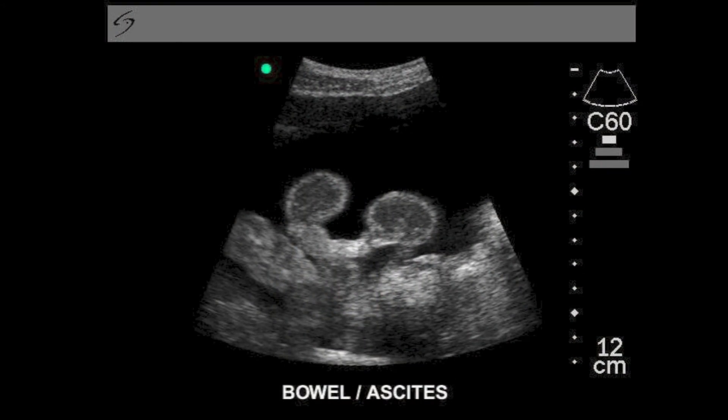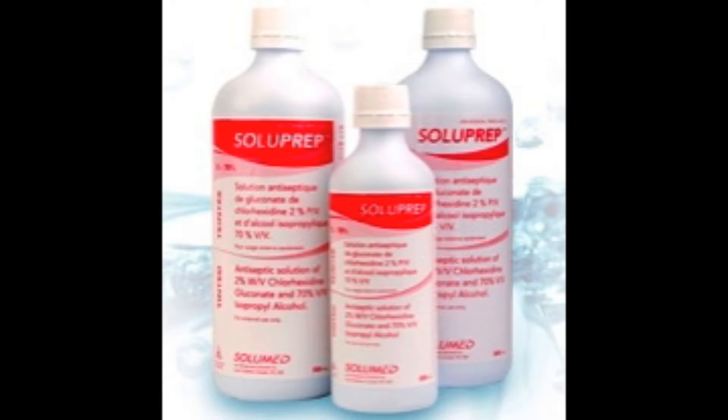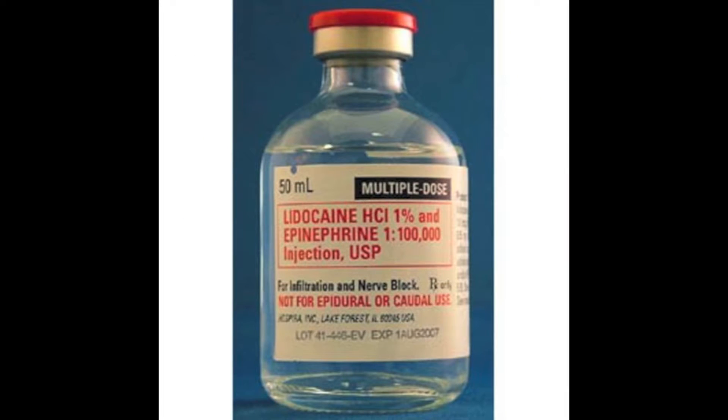Use your usual landmarks and point of care ultrasound to identify the best site for paracentesis. You would proceed with your usual sterile preparation and local anesthesia.